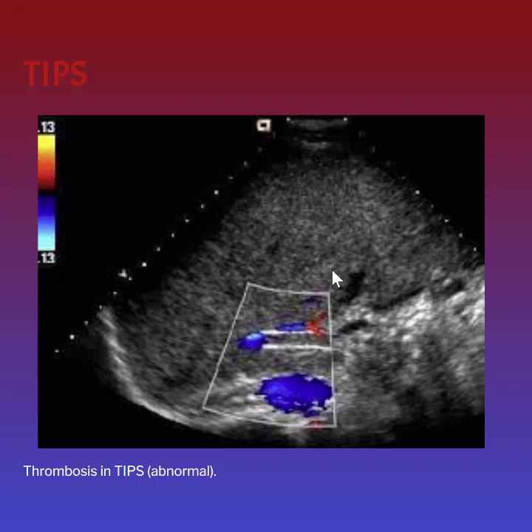I do want to point out again that this is not using the best physics. Remember, we don't get a Doppler shift recorded when we are 90 degrees to the ultrasound beam. So you do want to make sure that you're using correct windows, so we at least have some angle on the portal shunt to best evaluate the color flow through there.